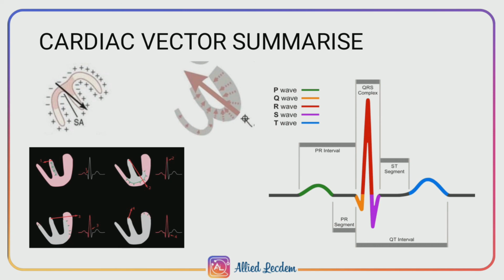When the cell is electropositive, the ST segment is neutral, at the baseline. When ventricular repolarization occurs, the T wave is noted, that is, a negative vector moving towards the negative pole results in a positive vector, that is the T wave.